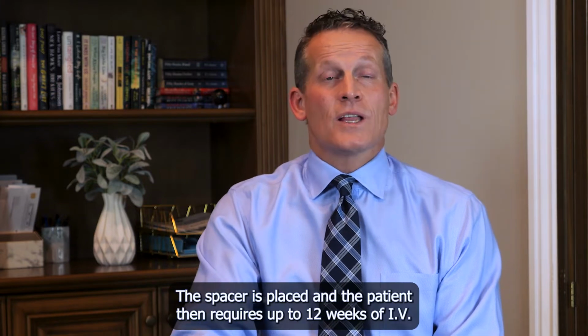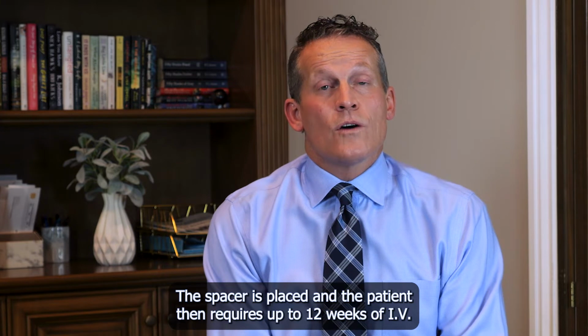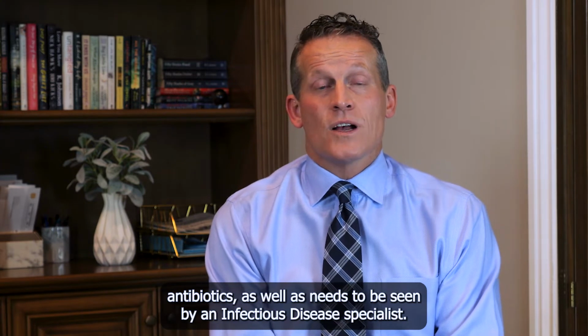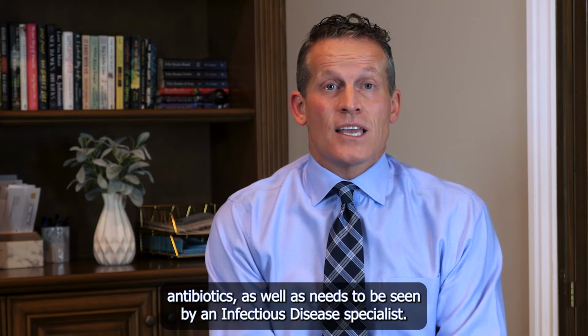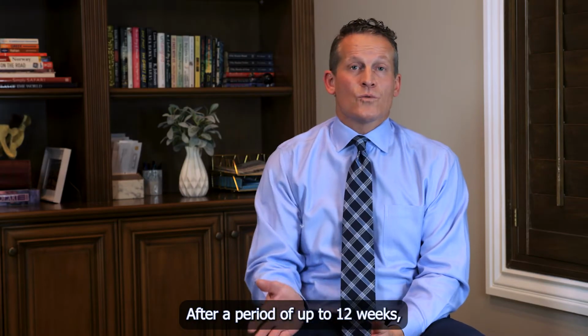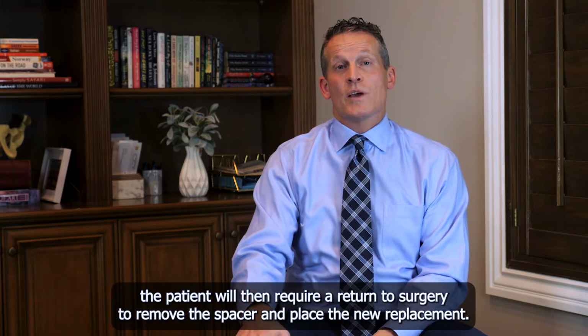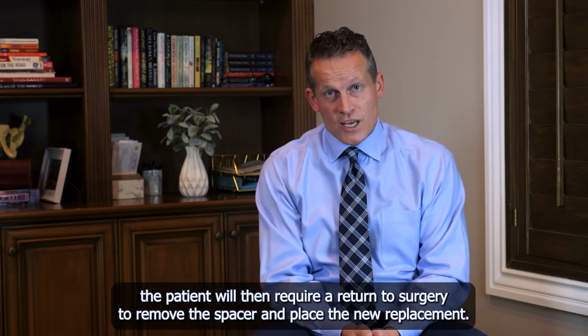The spacer is placed, and the patient then requires up to 12 weeks of IV antibiotics, as well as needs to be seen by an infectious disease specialist. After a period of up to 12 weeks, the patient will then require a return to surgery to remove the spacer and place the new replacement.